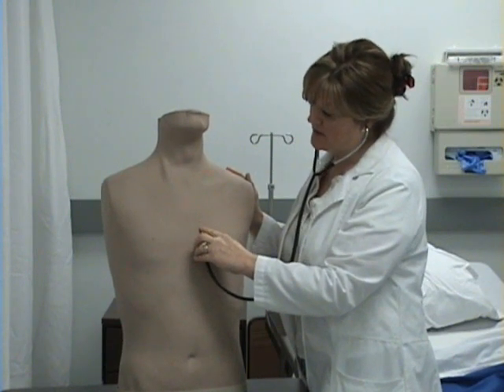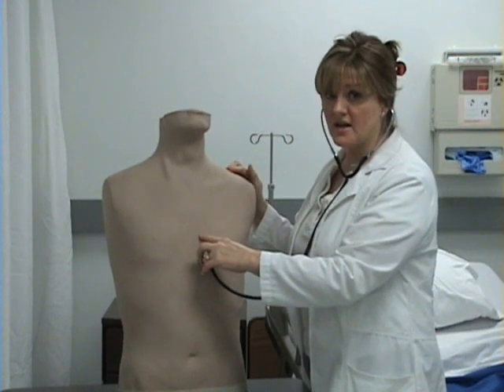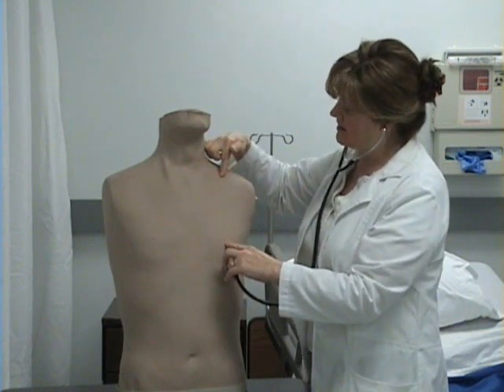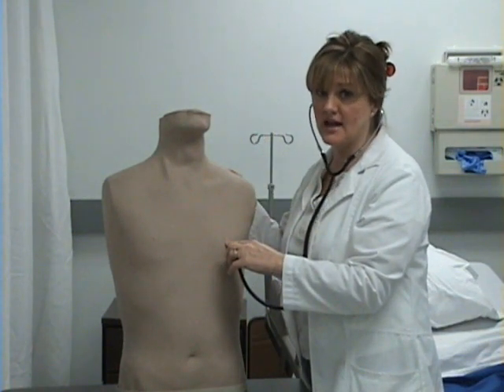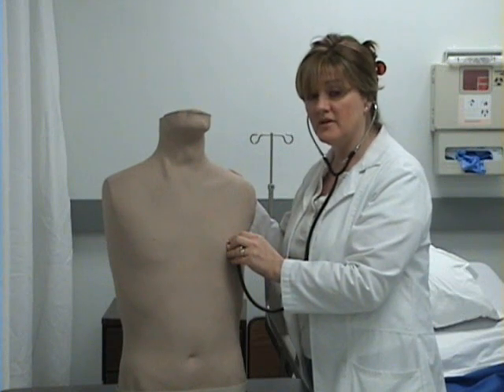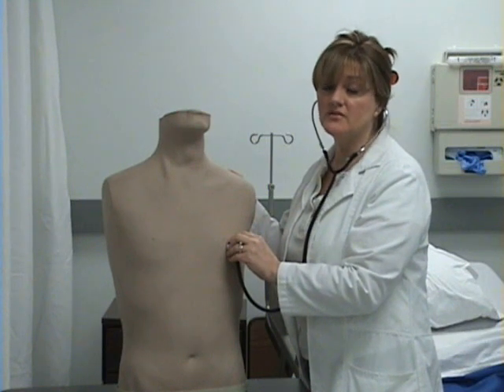Finally, I'll move down to the fifth intercostal space, left mid-clavicular line. I found the fifth intercostal space. Now I need to move across so that I'm at the midpoint of the clavicle. So it's fifth intercostal space, left mid-clavicular line. I'll listen. This is the mitral valve, and S1 is louder than S2. This is where you're going to listen for the apical heart rate, and you'll listen for 1 full minute.